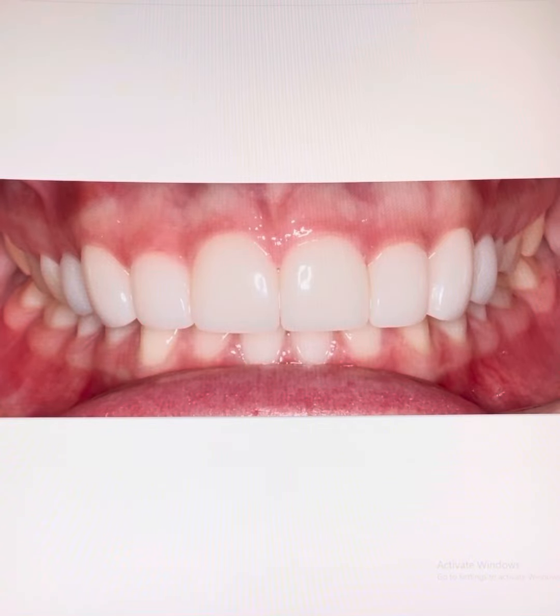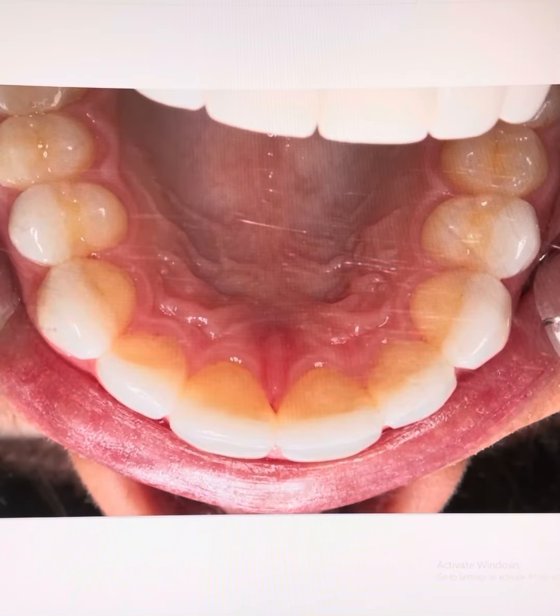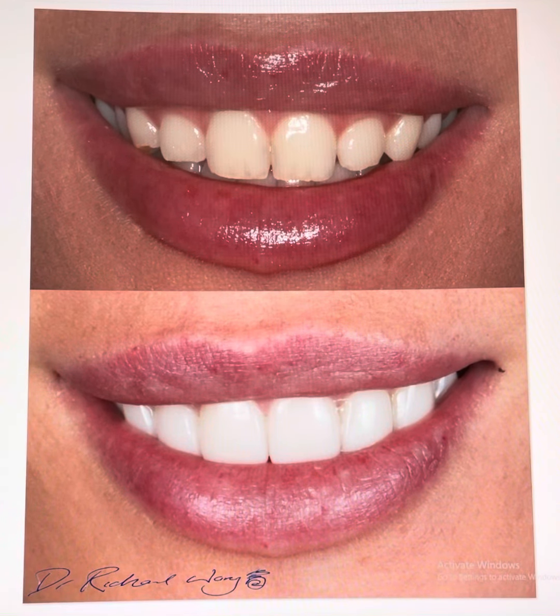Then the veneers go on just like that. Here is the back surface of the teeth and veneers with the mirror reflection view of the upper front teeth. Everything is polished until glassy smooth. Super happy patient — looking stunning. Smile Makeover Volume 16 is complete. Bye-bye.